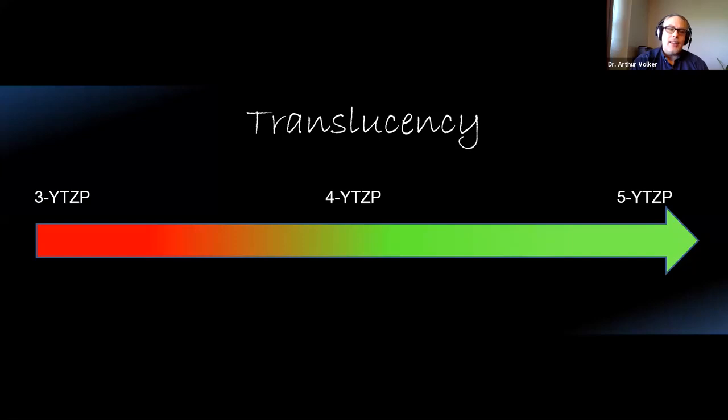And what that essentially means is that zirconia is a very unstable element in its tetragonal form. So there's basically 3 shapes of zirconia. I promise I will not torture you all with this, but I just want you to know that to keep zirconia stable, they have to add a metal to it. Typically, it's something called yttria. They also use the metal called ceria, which I thought was going to be more popular, but yttria proved more popular. And they would use it to help keep the zirconia stable. Now, the thing is, the less yttria, in other words, that's by mole percentage, the less yttria, the stronger the zirconia.